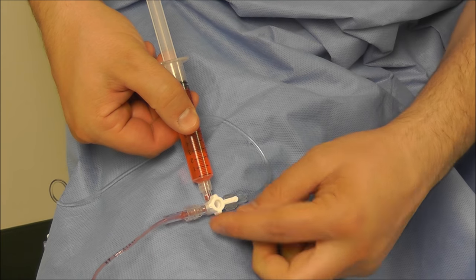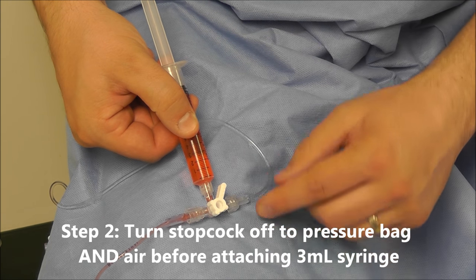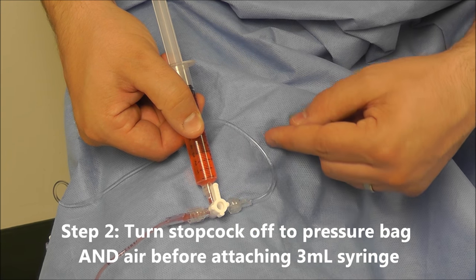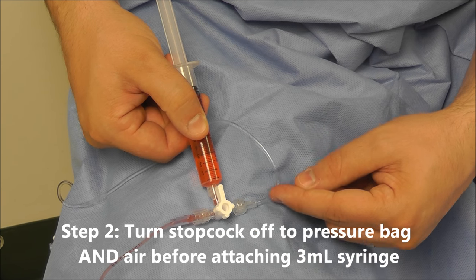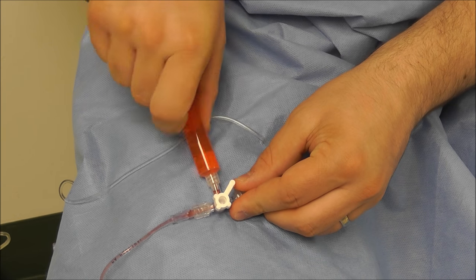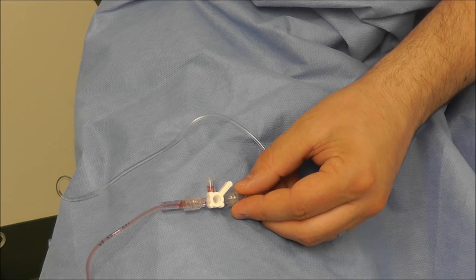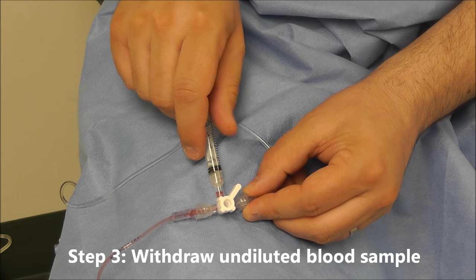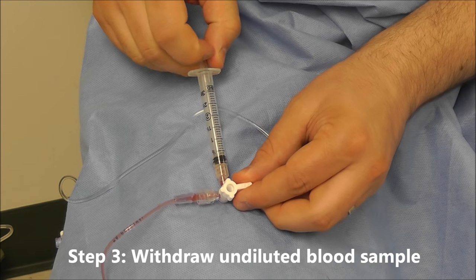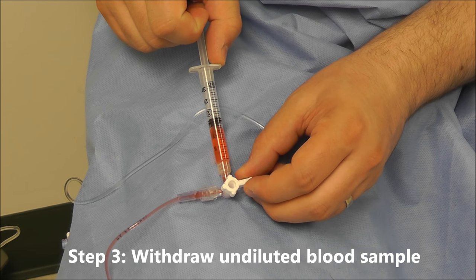Once we get the 10ccs, we can turn our stopcock off. However, we want to make sure it's at a 45 degree angle, because if it's upright, it can reintroduce pressurized saline into our sample and dilute it. Once the stopcock is off at the 45 degree angle, we attach a 3cc syringe, and then we can draw our undiluted sample.